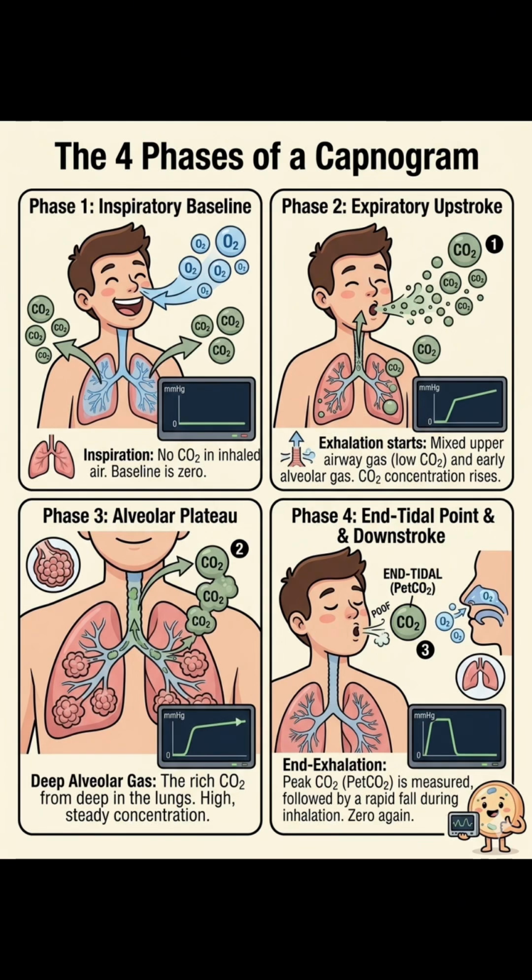And then finally comes inspiration. Fresh gas enters the lungs, carbon dioxide immediately drops back to zero, and the cycle begins all over again. A normal capnogram looks almost like a square wave. When that square changes shape, your patient is trying to tell you something.